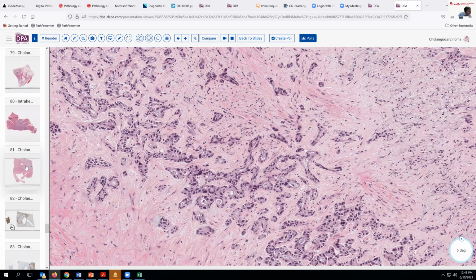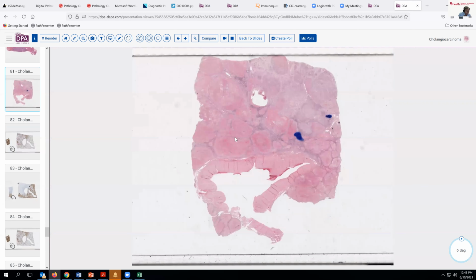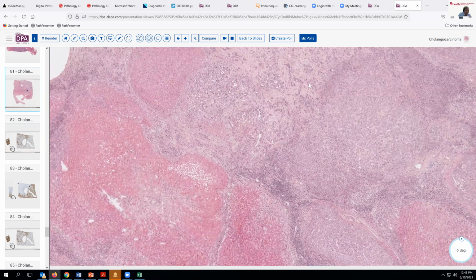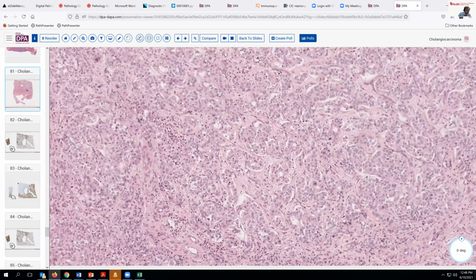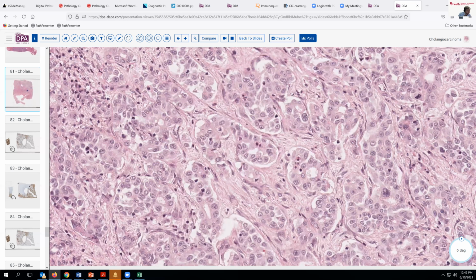In terms of immunohistochemistry, let's look at this case. And here we see a background of cirrhosis. And here's our tumor, this more pale area. Again, we're seeing this sort of wildly configured small glandular pattern in some areas, and the more solid, pseudo-solid nested pattern here in these other areas. Kind of a low-grade neoplastic appearance, fairly uniform rounded cells, prominent nucleoli, a little bit of vesicular chromatin pattern.